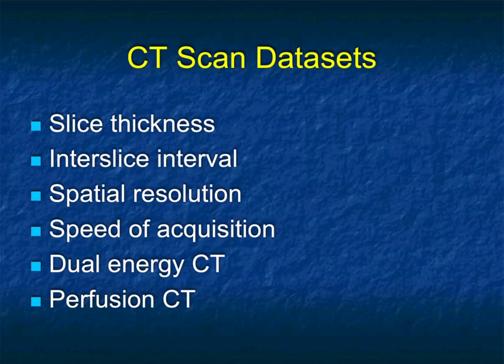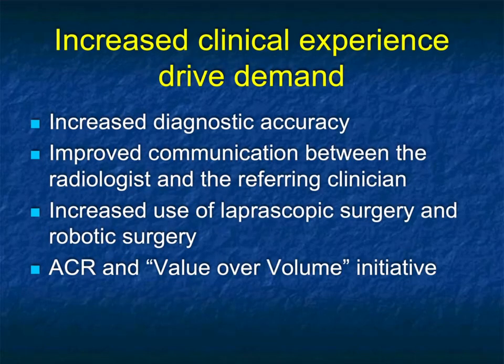As we go forward, the newest thing in CT is photon counting CT, and that should provide better images for us, but more tissue characterization, which could lead to all sorts of new applications. But we'll see what happens there.